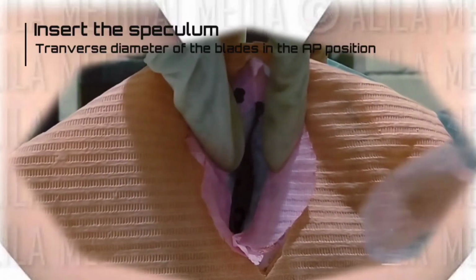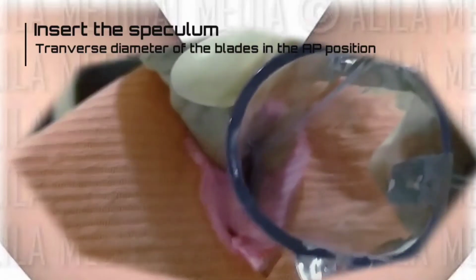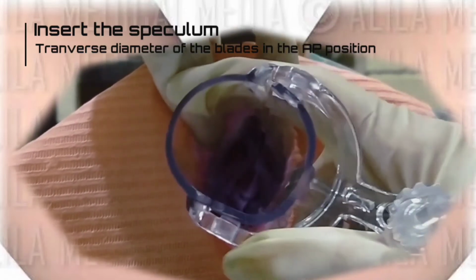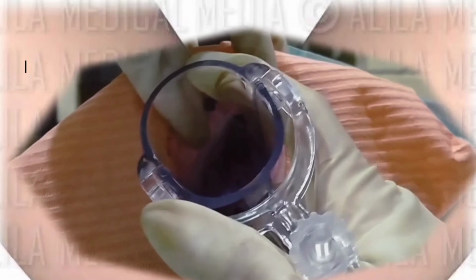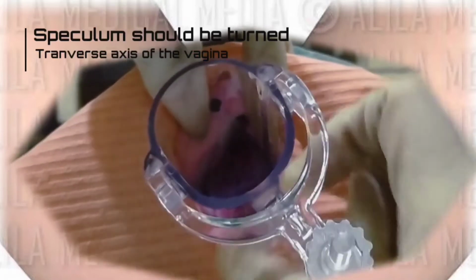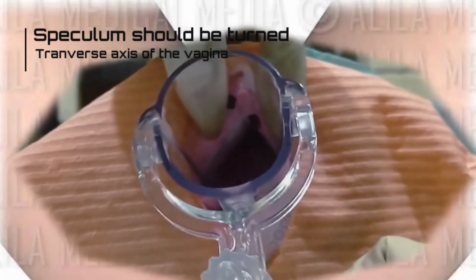Insert the speculum by placing the transverse diameter of the blades in the antero-posterior position and guiding the blades through the introitus in a downward motion with the tips pointing towards the rectum. Once the blades are inserted, the speculum should be turned so that the transverse axis of the blade is in the transverse axis of the vagina. The blades should be inserted to their full length.